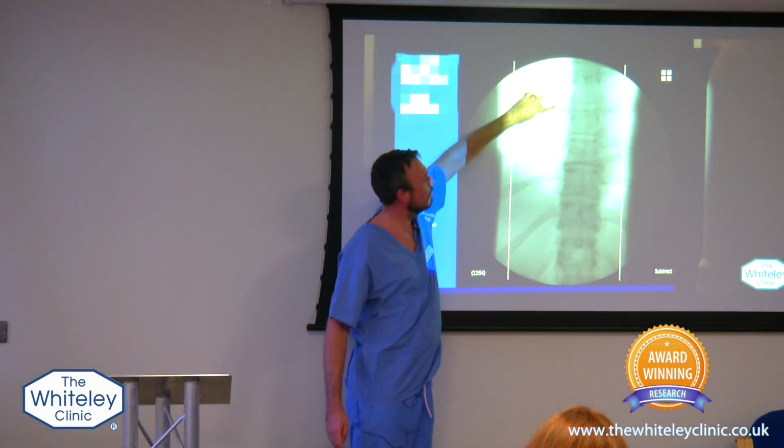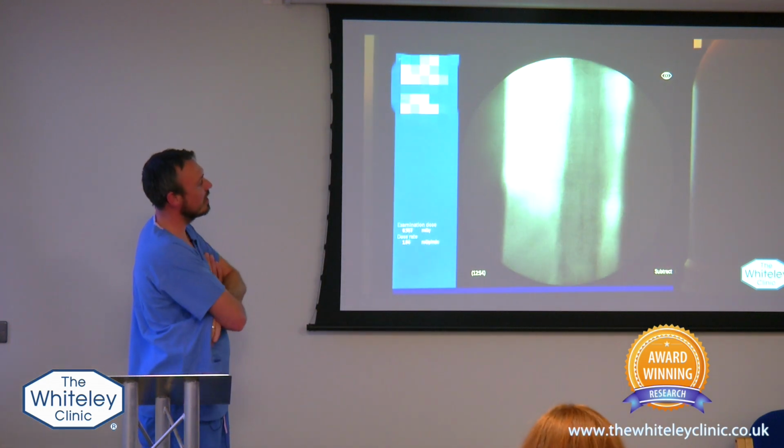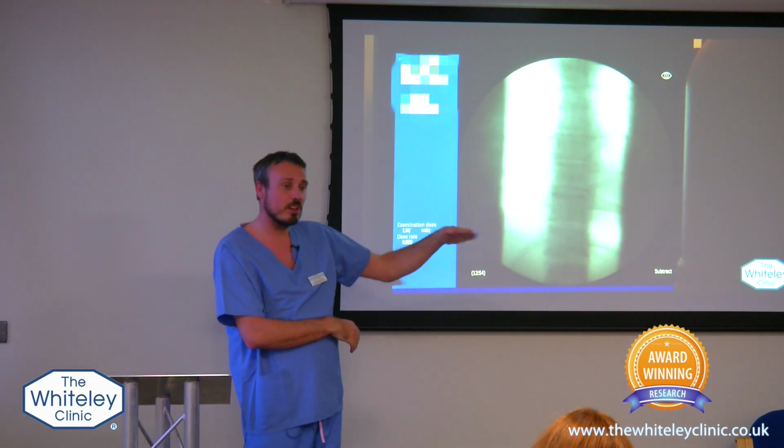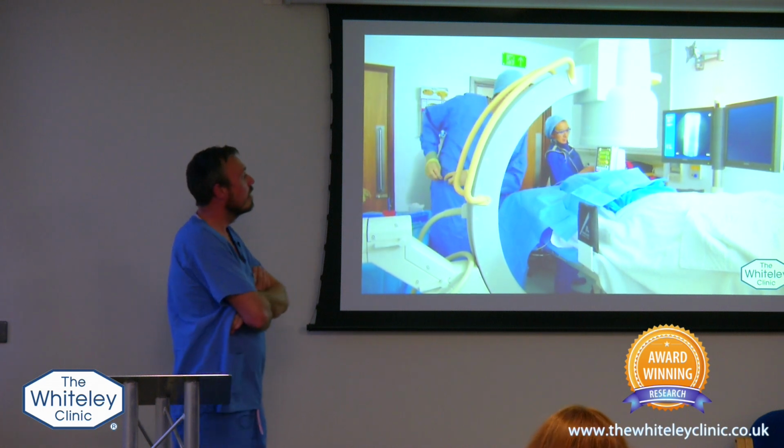This is the catheter that's coming down, okay? The X-rays are just allowing me to visualize that catheter, and then I can steer that catheter. You can see it hasn't got much of a curve on it. It's only got a tiny little angle like that. So that's what I mean about needing a straight route.